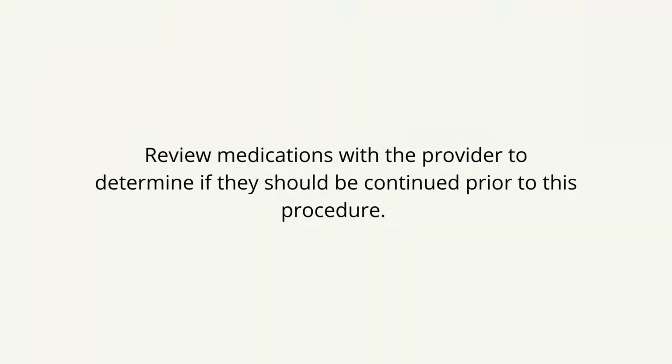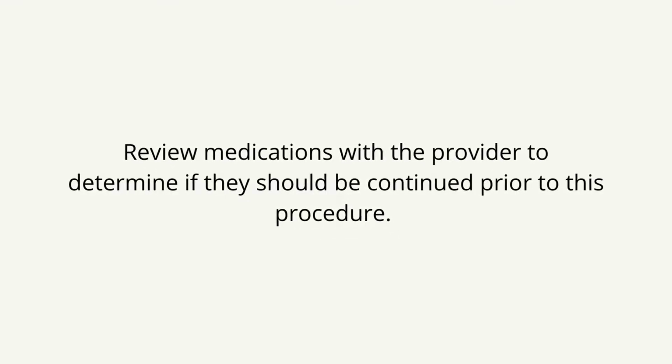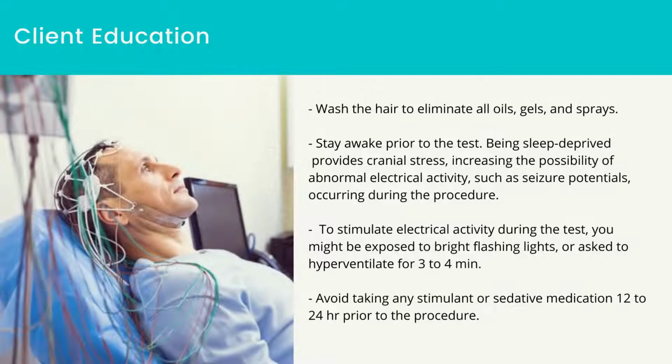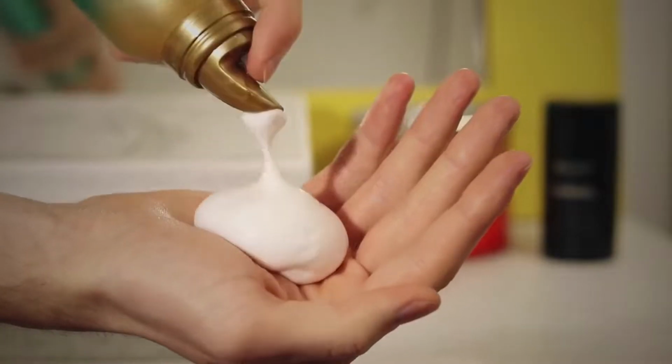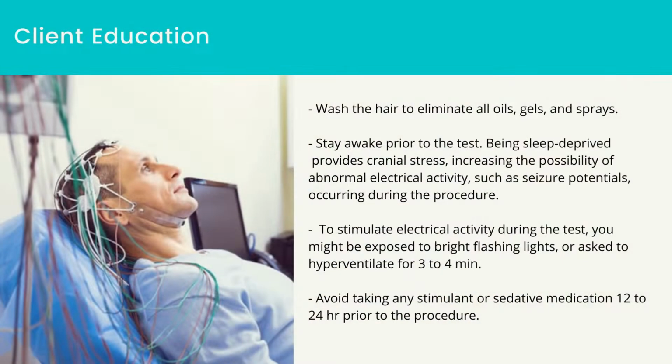Pre-procedure. Nursing actions. Review medications with the provider to determine if they should be continued prior to this procedure. Client education. Wash the hair to eliminate all oils, gels, and sprays. Stay awake prior to the test.